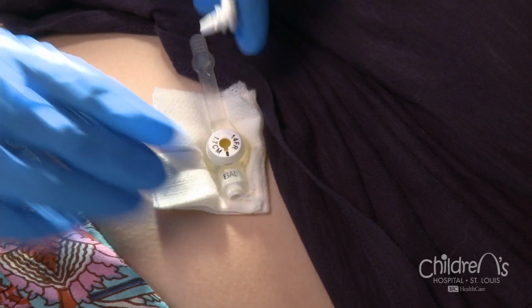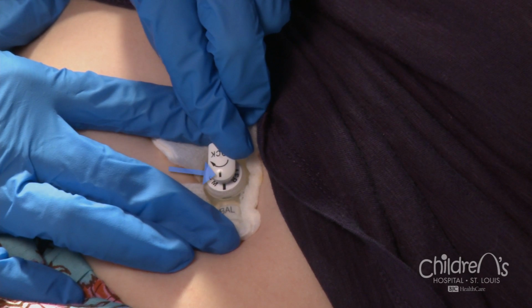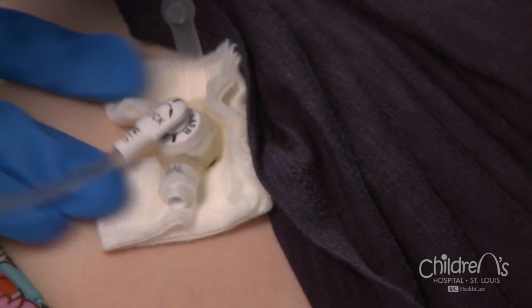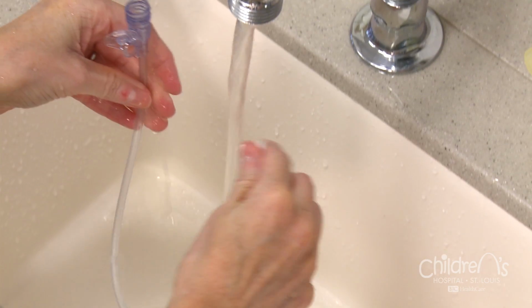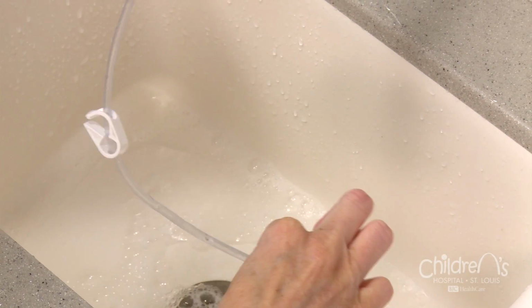Hold the button in place with one hand. With the opposite hand, take the extension set and line up the black line on the extension set with the black line on the button. Gently push the extension set into the button. Turn the extension set clockwise, at least 1/4 turn, to open up the valve and secure the device in place. Now it is ready to be used for giving meds, feedings, or water flushes. When not using the extension set, it should be disconnected from your child and cleaned with soap and water. Rinse and air dry. Do not ever boil the tubing or place it in the dishwasher or microwave.